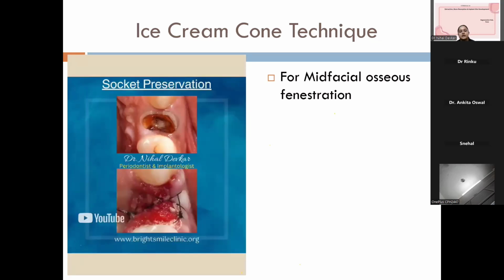And I would also like to ask, what are the instruments that we should use during the process? All right. As I mentioned, your first primary target should be to do a flapless atraumatic extraction. If possible, you can use a periotome. If you have any tunneling instrument, you can use it to create a small tunnel on the facial as well as the lingual side without raising the papillae. Don't disturb the papillary blood supply.